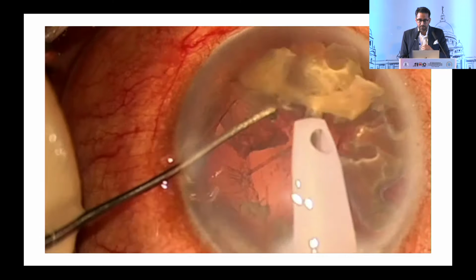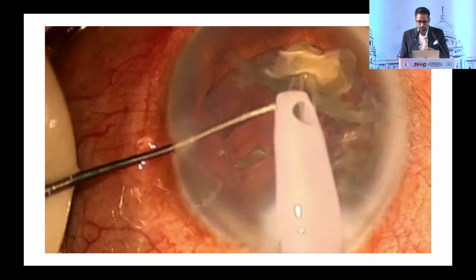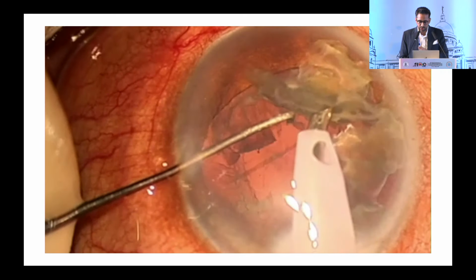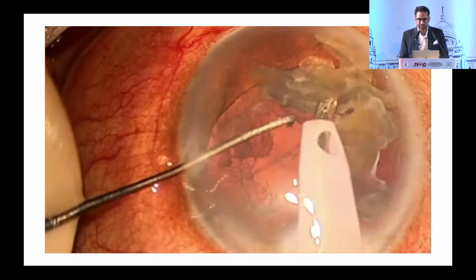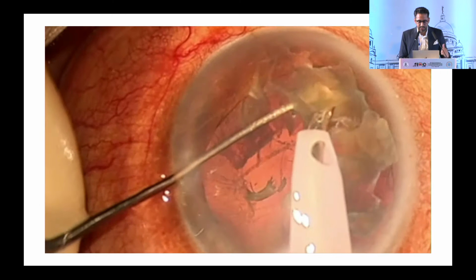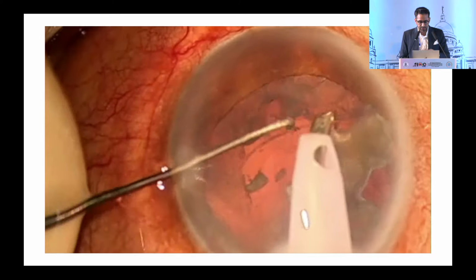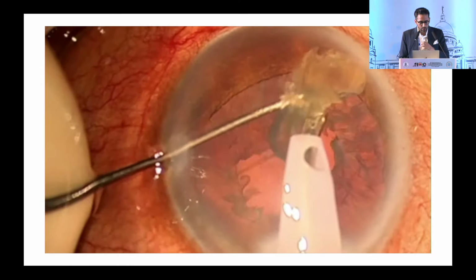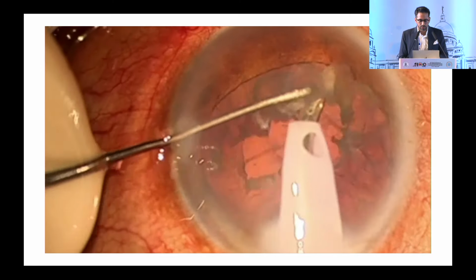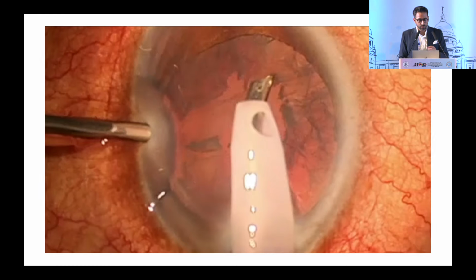So I can prevent the disruption of the hyaloid face, and you'll see that these nuclear pieces just float in the anterior chamber; they won't go behind. All these factors, as told by Dr. Rohit in his previous presentation, the prerequisites, good calibration, no leakages, allow you to complete even a hard cataract in a posterior polar cataract with a pre-existing PCR.